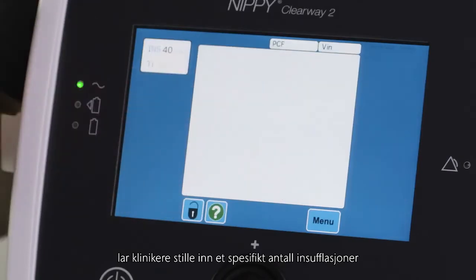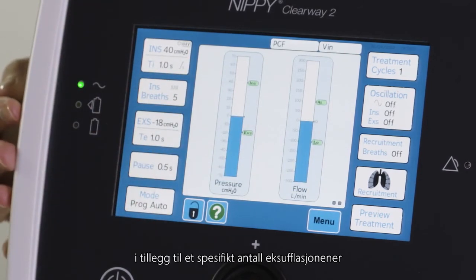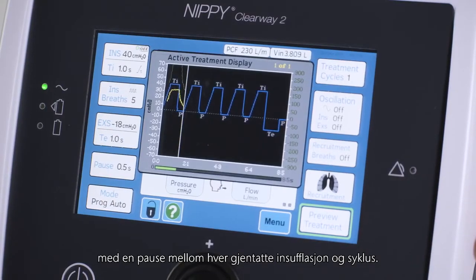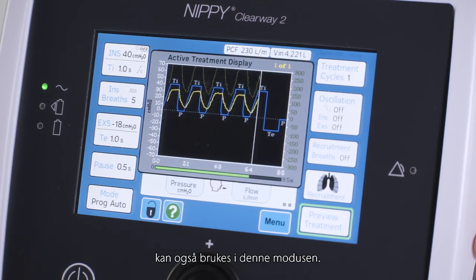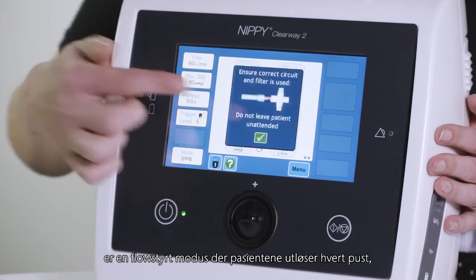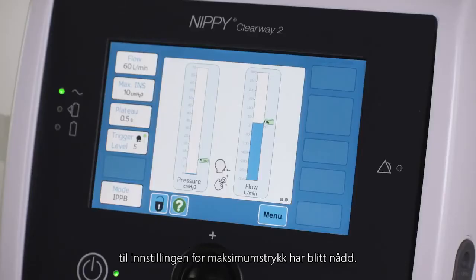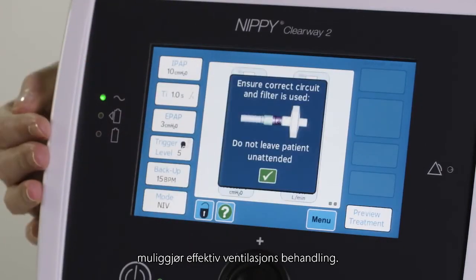Program mode allows clinicians to set a specific number of insufflations before an exsufflation, as well as a specific number of exsufflations with a pause between each repeated insufflation and cycle. Other features such as allowing patients to trigger the insufflations can be applied in this mode also. Intermittent positive pressure breathing, or IPPB mode, is a flow controlled mode where patients trigger each breath, which is then delivered at the prescribed flow rate until the maximum pressure setting has been reached. Non-invasive ventilation, or NIV mode, allows for the provision of therapeutic ventilation.